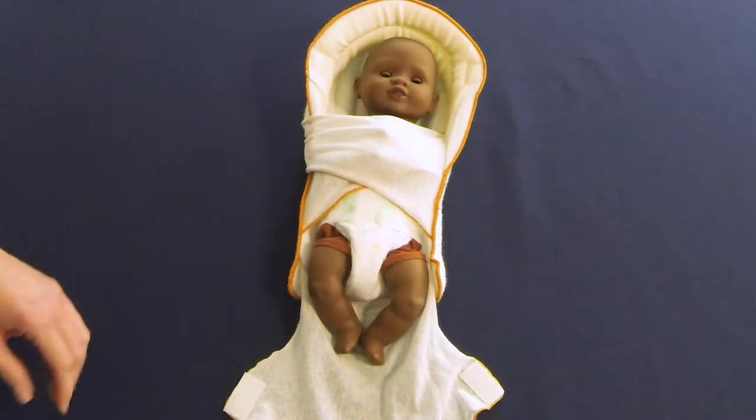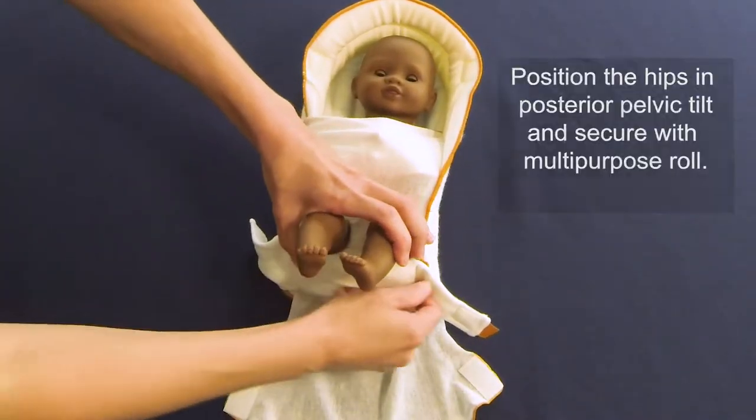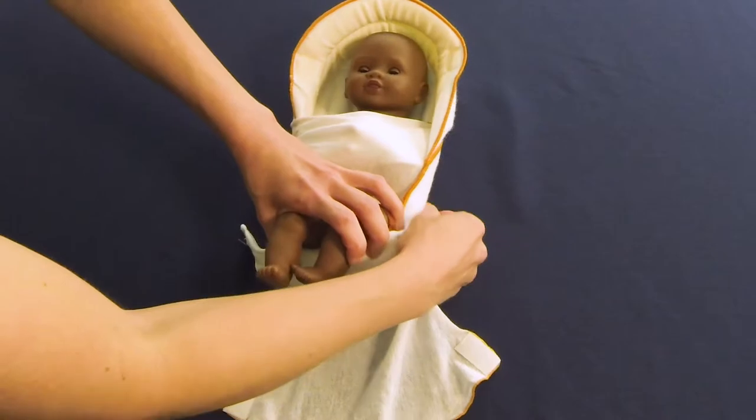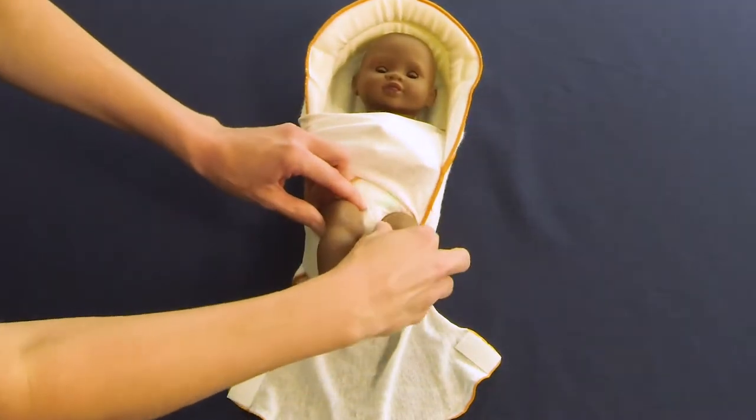Round the baby's lower back into a posterior pelvic tilt by bending the knees at a 90-degree angle and tucking them toward the abdomen. Place the multipurpose roll beneath the baby's buttocks and thighs as though they were seated in a swing, and secure it to the back of the positioner.